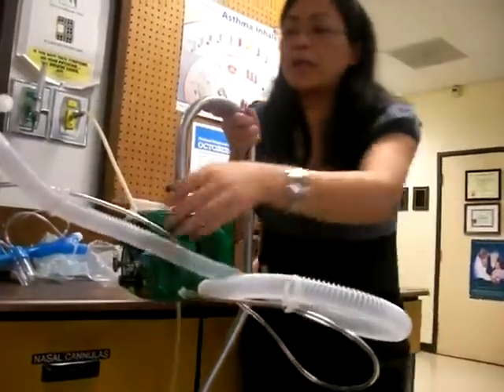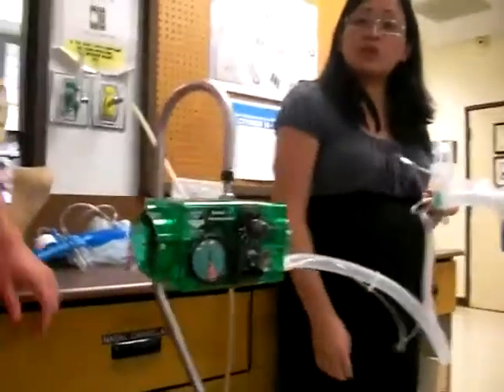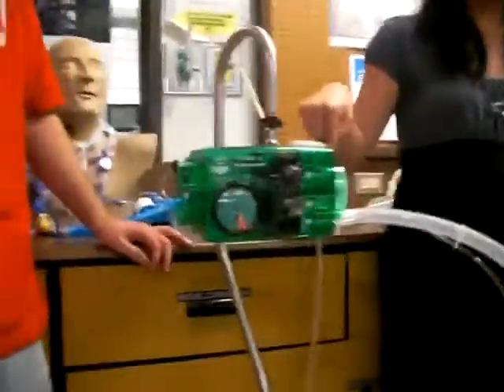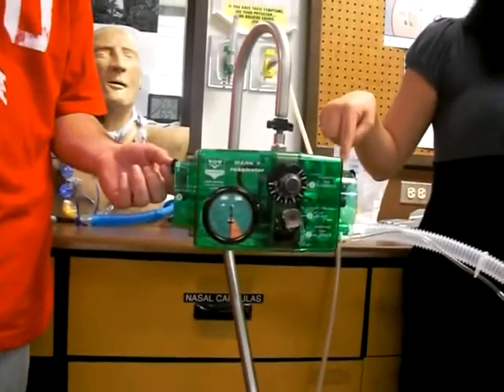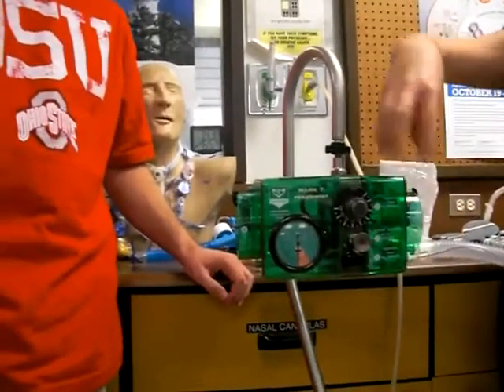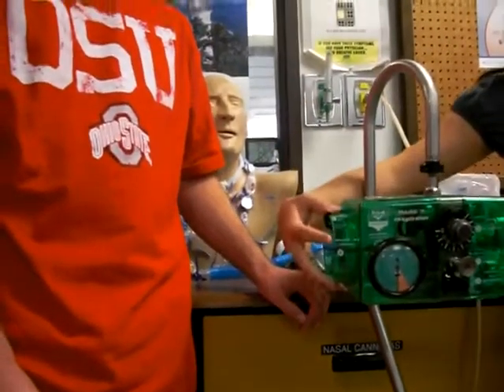So Bo is going to be our guinea pig here. What did we say? The RT sets the pressure, the flow, and the sensitivity. Where is the pressure dial? Right here — number three. Candice, what number is this? Right-hand side — three. You set this part here, the pressure. You set the flow, which is in the front, and you set the sensitivity, which is on the left.